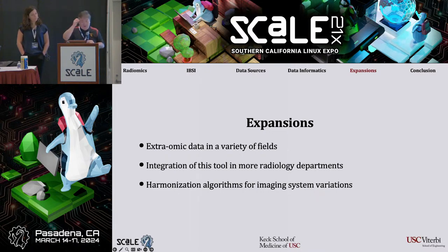And so one of the things that we're hoping, and it's a trend in radiology, is that quantification is becoming more and more pushed forward as a basic part of clinical work. And so, calculating the volume of a tumor has become more standardized. Before, it was just calculating the diameter of a tumor and saying, oh, that's 5 centimeters, we should probably take it out. Now it's calculating that this is actually 200 milliliters. Let's see how big it gets or how small it gets with treatment. And so that extra level of precision can lead us into better diagnosis, better prognosis of diseases.